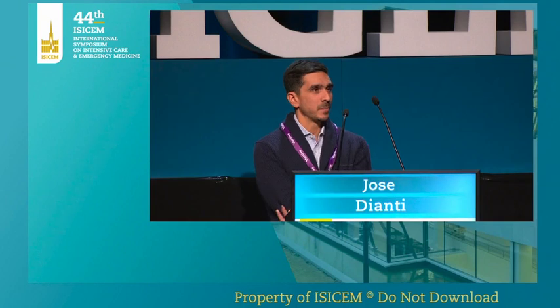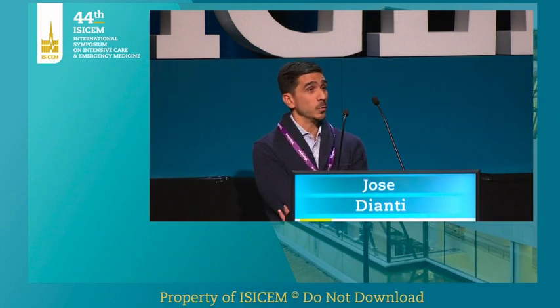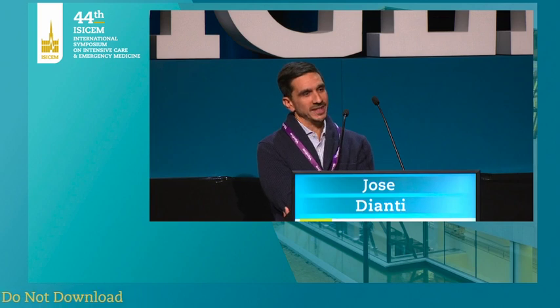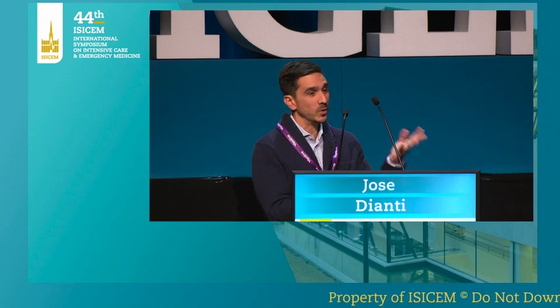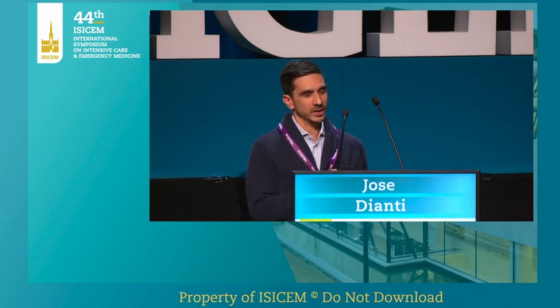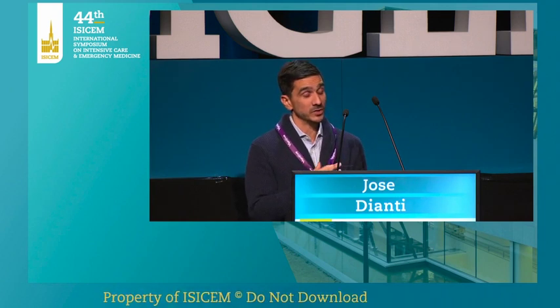Well, yeah, so I would say that for P0.1, which some ventilators actually display live on the screen, whereas others ask for a maneuver, and POCC, there are no major caveats in terms of doing the measurement. For POCC, I would say it is important that the patient is not aware that you're doing the measurement, because they might react differently and they might generate a larger respiratory effort. That happens when they feel that the occlusion is happening, but if they are aware of this, they might respond differently.